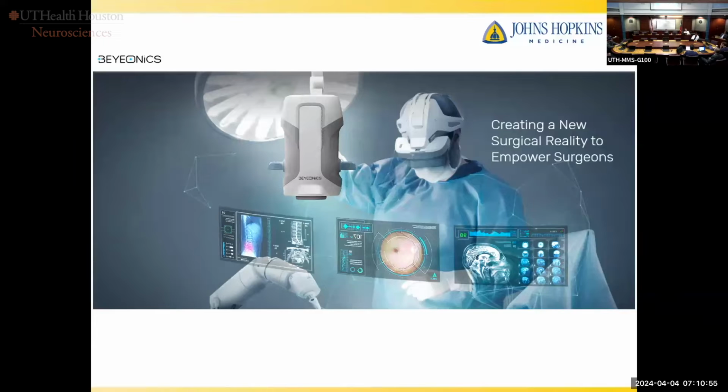And what they've also done is they've moved the camera higher up, so it's sort of out of your way, with very similar image quality. And they also have a pedicle screw placement platform. I think this may be something that actually takes off both for cranial surgery and potentially spine surgery. So that's one to look at in the future.